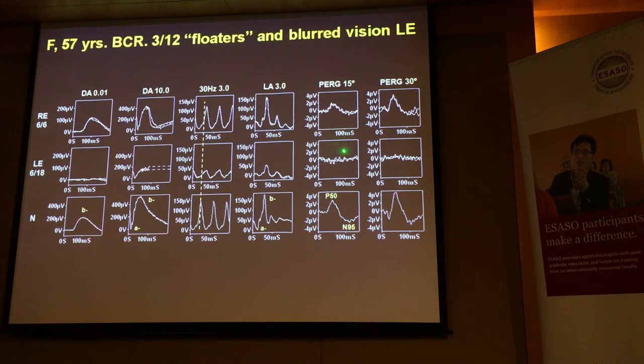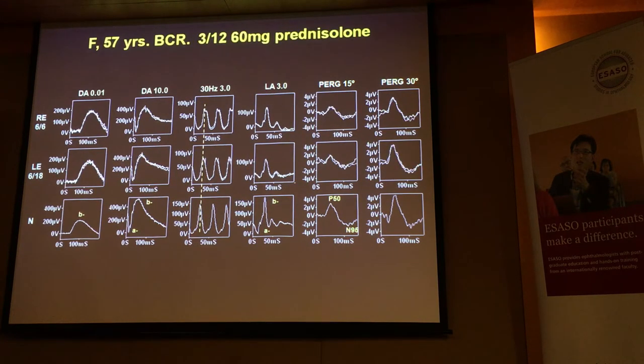Pattern ERG recovers, and this is successful treatment. So you can objectively demonstrate the efficacy of treatment. You can then tail the treatment off slowly, because if you do it too quickly, you get a rebound, which is harder to treat. And you can then modify your treatment regime, monitoring it with ERG to determine that you've got stability.